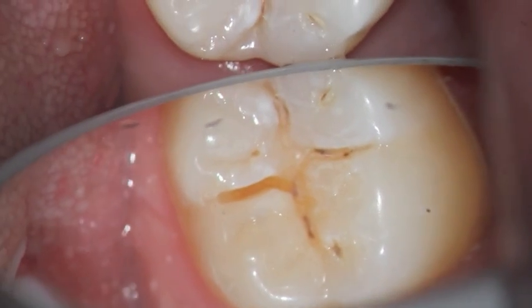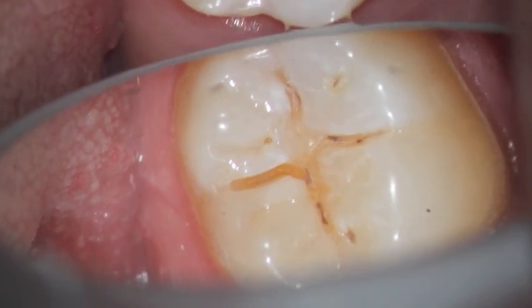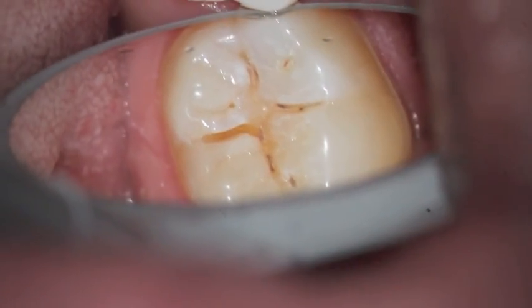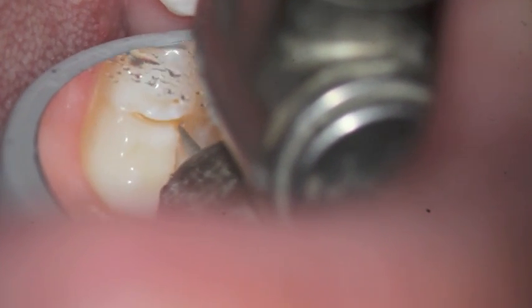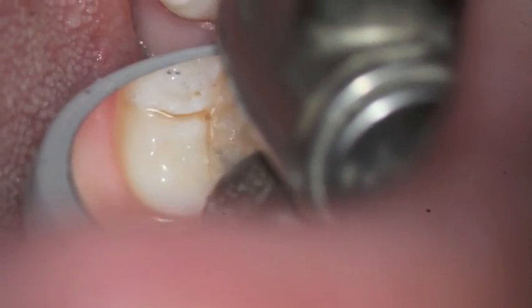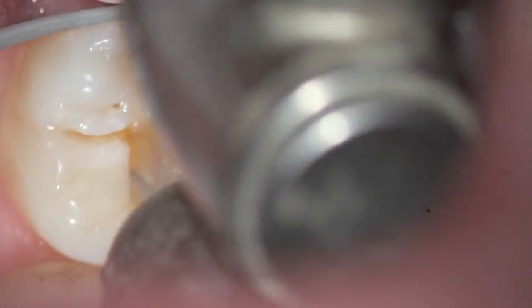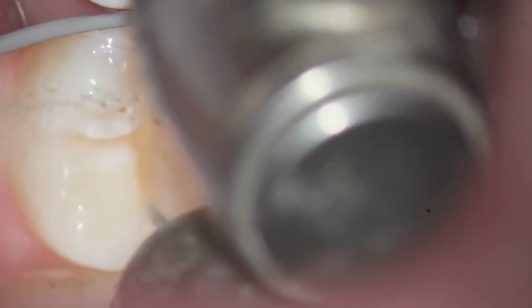that's presently seen. And so we go in and we're using very fine instruments to remove the enamel because we'd like to keep it as small as possible. You can see the little mosquito drill bit there, which is, all my drill bits are disposable, by the way, just for the one patient. And here's a close-up of some more of the brown stain and the brown decay.